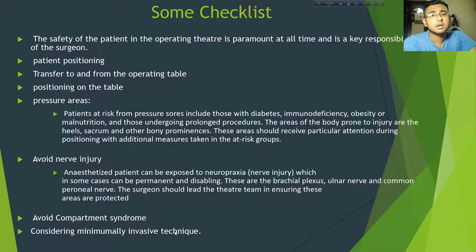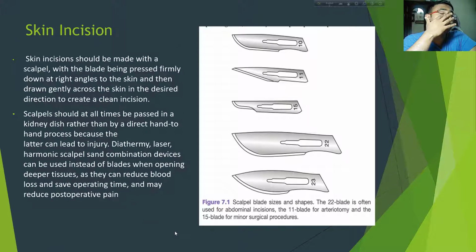Nowadays minimally invasive technique is chosen as a modern technique to minimize the injury and to minimize the hospital stay. So here first is skin incision. Skin incision is the first step of basic surgery.